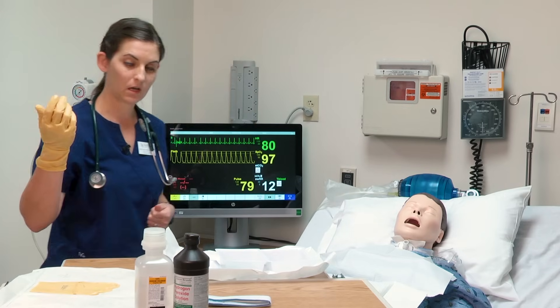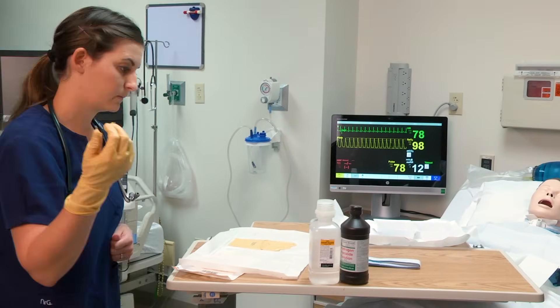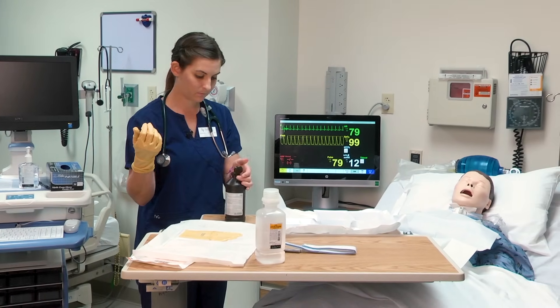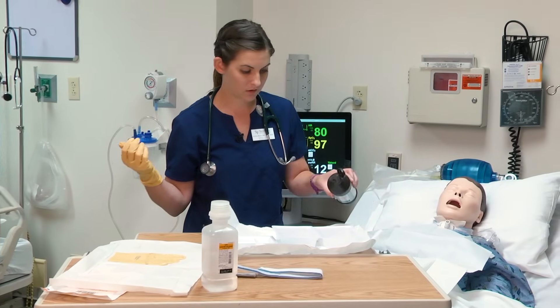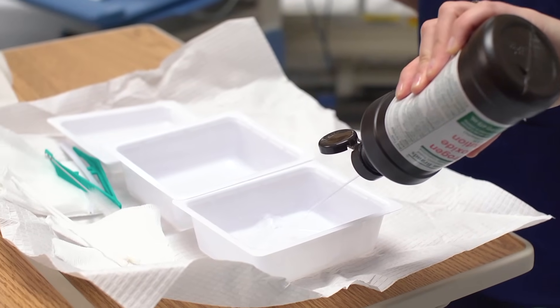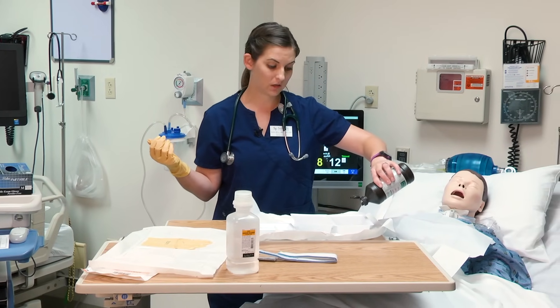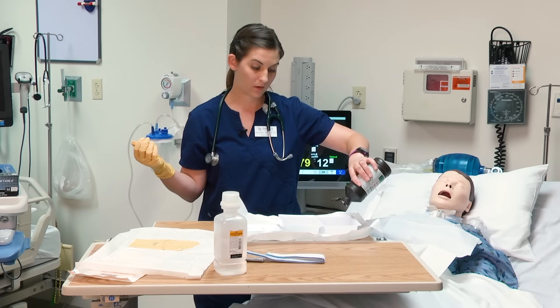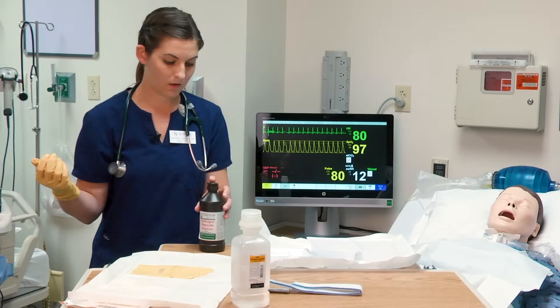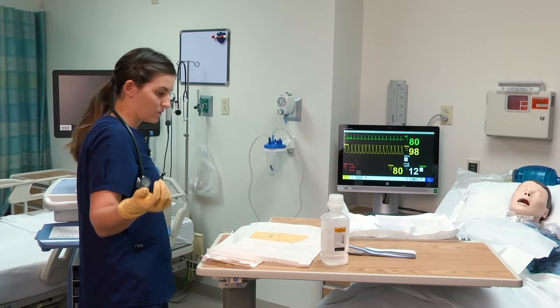I'm going to walk around the table without leaning over my sterile field to get my hydrogen peroxide. Hydrogen peroxide goes into the first container. I need enough to clean the entire inner cannula. I'm not turning my back on my field.